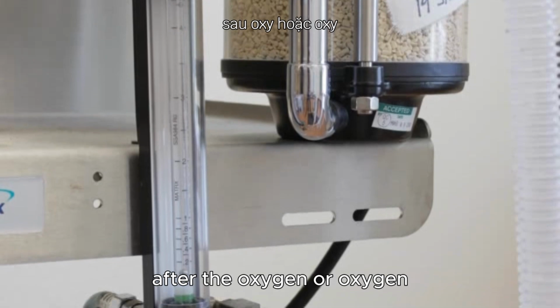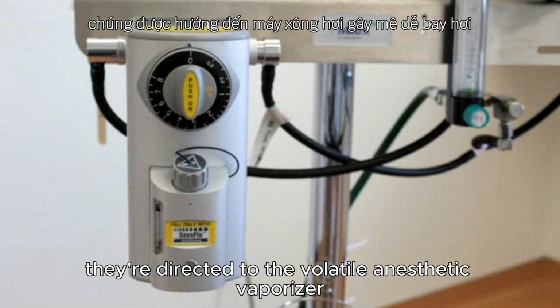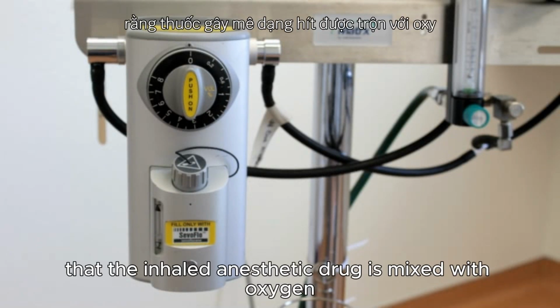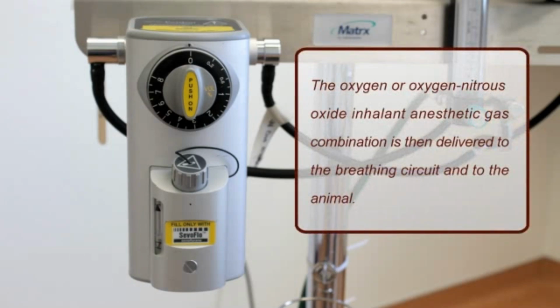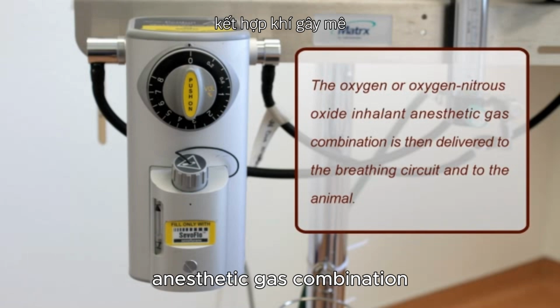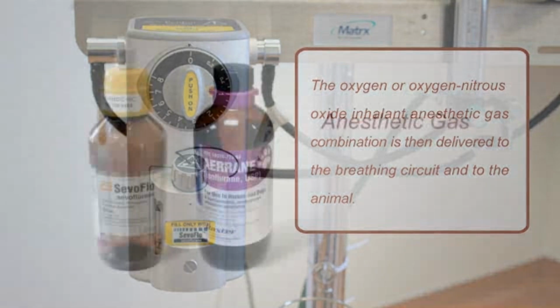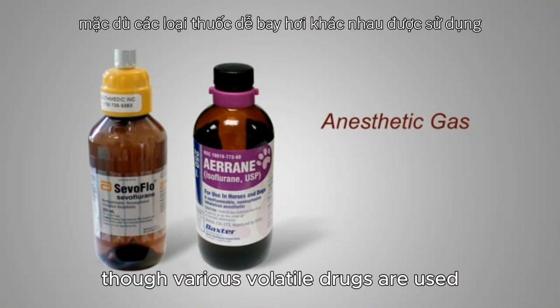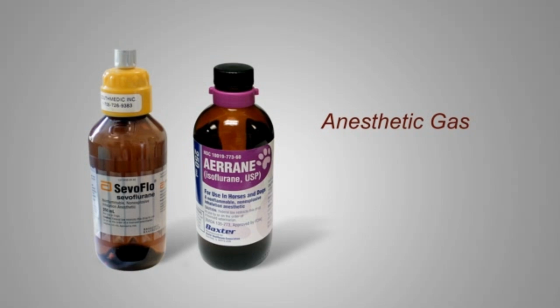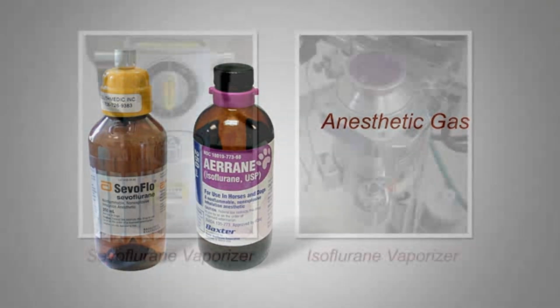After the oxygen or oxygen and nitrous oxide pass through their respective flow meters, they're directed to the volatile anesthetic vaporizer. It's here that the inhaled anesthetic drug is mixed with oxygen. The oxygen, or oxygen nitrous oxide inhalant anesthetic gas combination, is then delivered to the breathing circuit and to the animal. Though various volatile drugs are used, the two most common are isoflurane and sevoflurane.